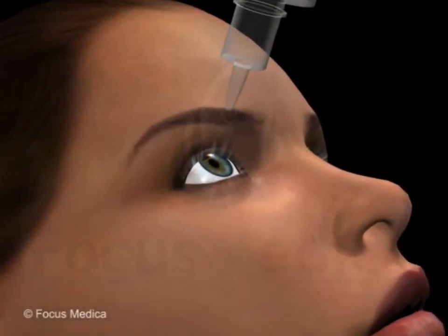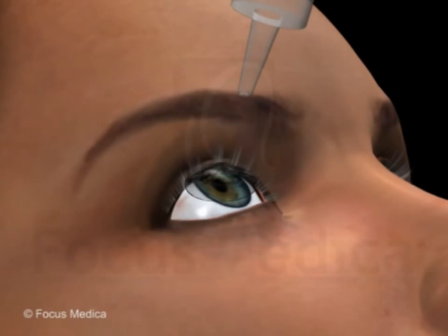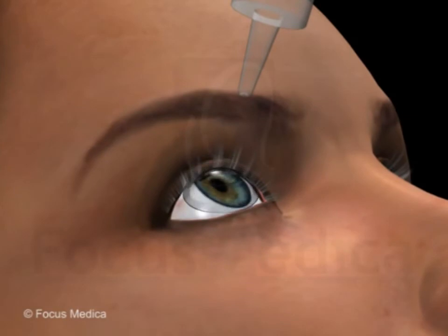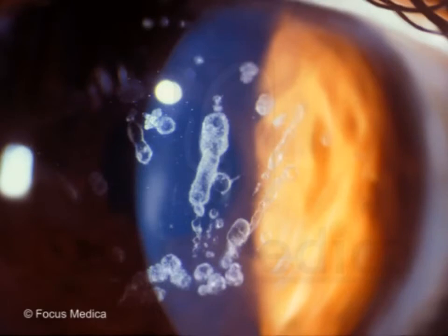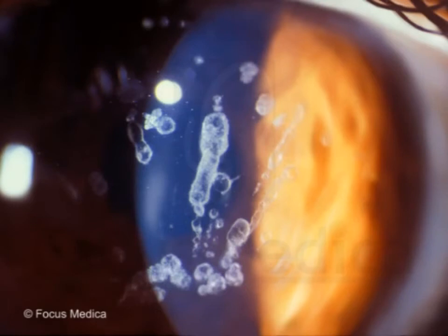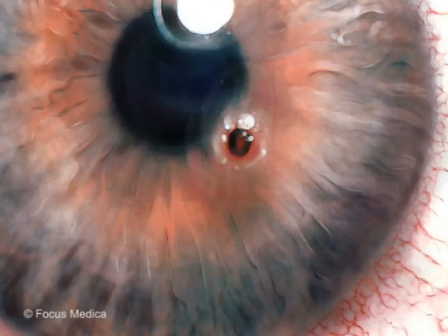An adaptation of this examination uses fluorescent dye eye drops that allow easy detection of an injured or infected area on the cornea and also foreign objects.